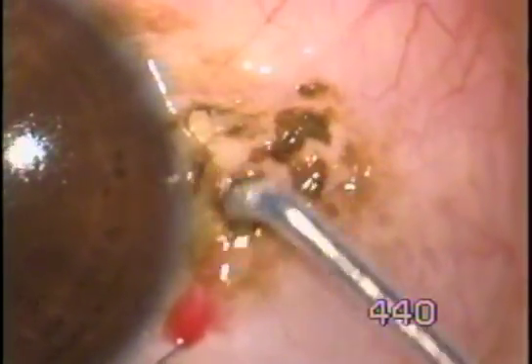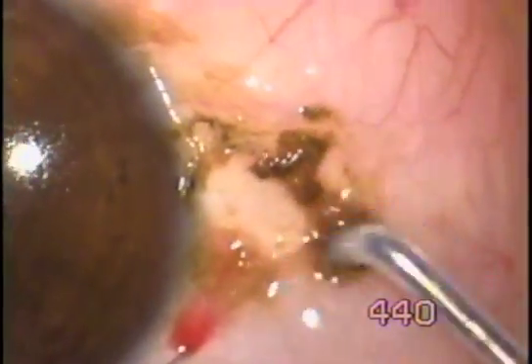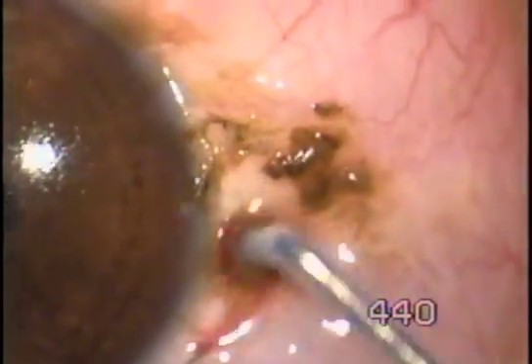Keep the tip moving over the surface of the nevus, and the nevus gets erased.